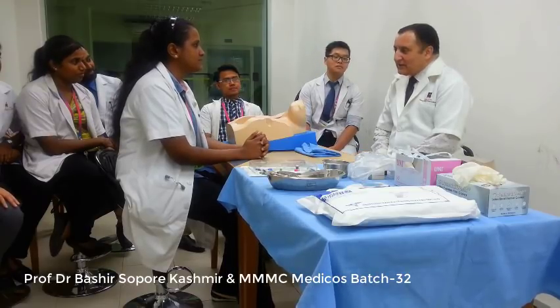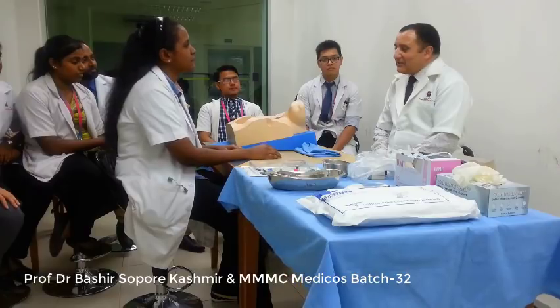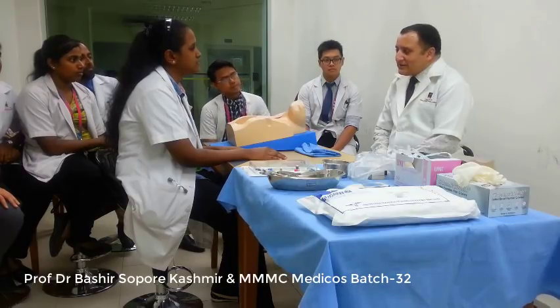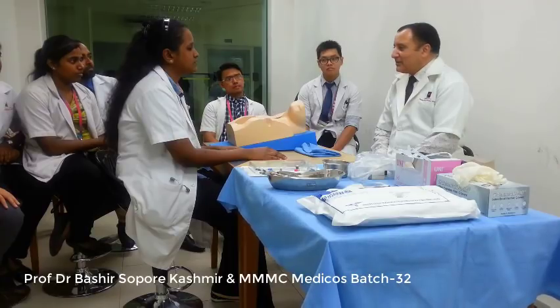Now let me tell you here that whenever we have to do central venous catheterization, we usually use the internal jugular vein. What is the reason why we use the internal jugular vein?